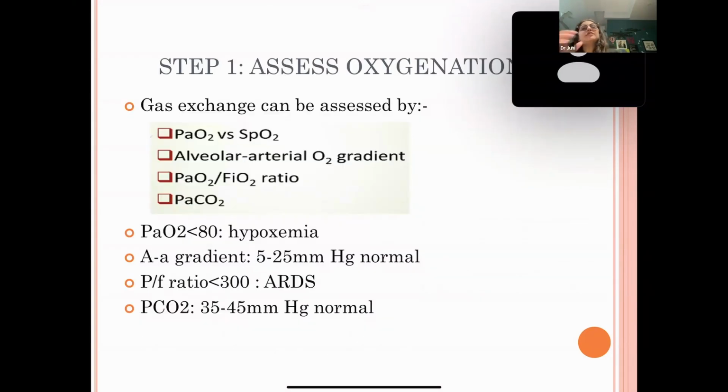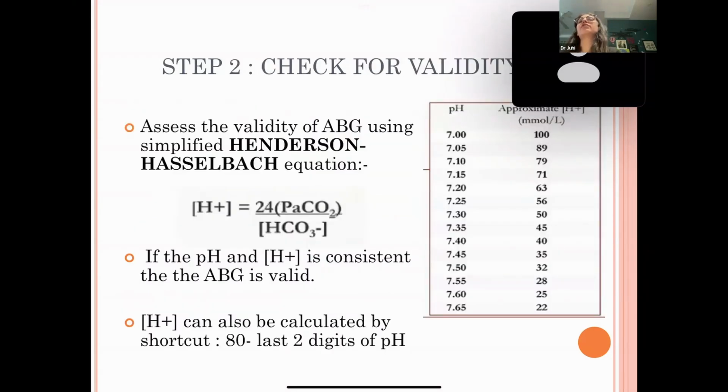Okay, so first step, just remember this, I've put it first because if you have a low PO2, at least I want you to intervene first rather than going for further interpretation. Okay, otherwise ABC is lost.